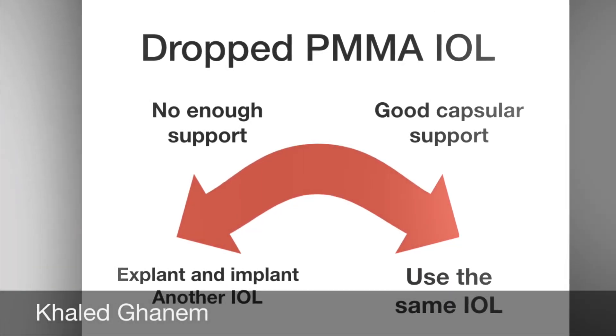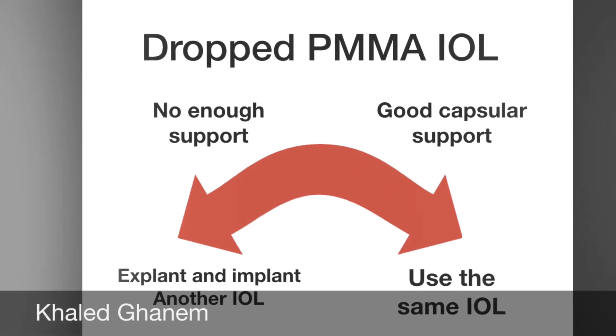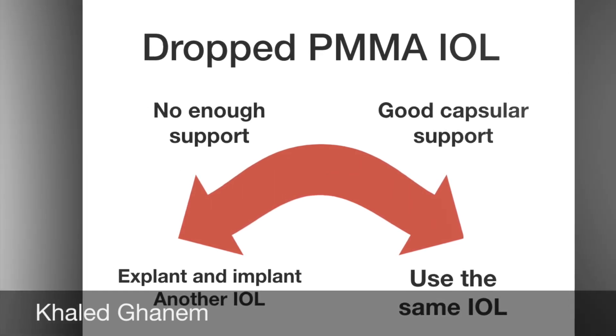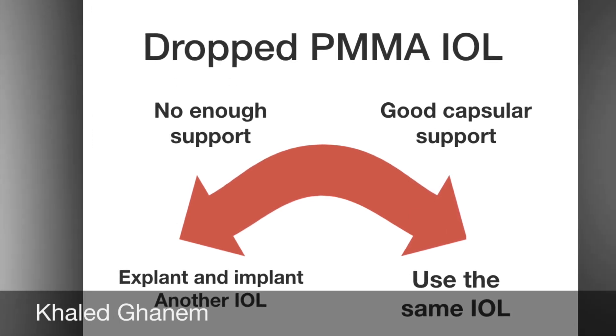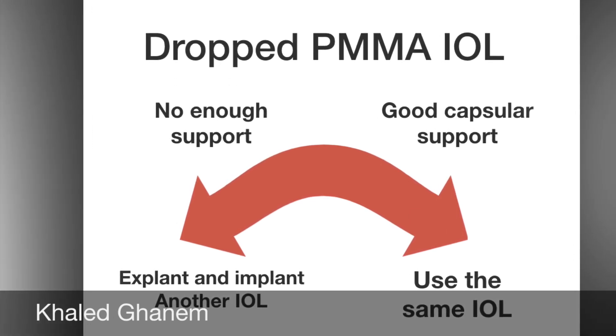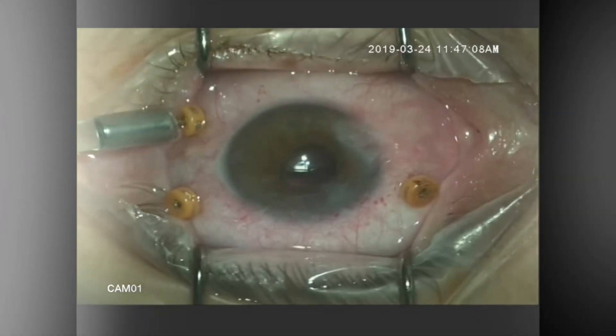When managing a dropped PMMA IOL, you should keep in mind that you either have good capsular support and will use the same IOL, or there is not enough support and you will explant it and implant another IOL. Here I am going to show the steps of explanting a dropped PMMA IOL in an easy way.